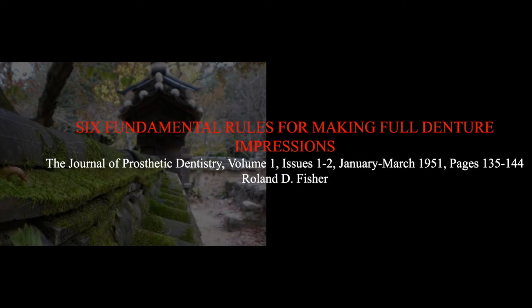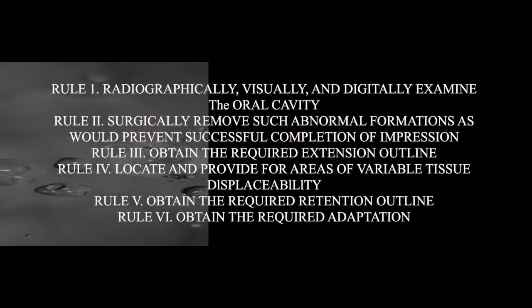One of the classic articles discussing the fundamental rules for making denture impressions was published in 1951 by Dr. Roland Fisher. He made 6 rules. Rule 1: radiographically, visually, and digitally examine the oral cavity. Basically, you are carefully examining the existing condition before you start the treatment.